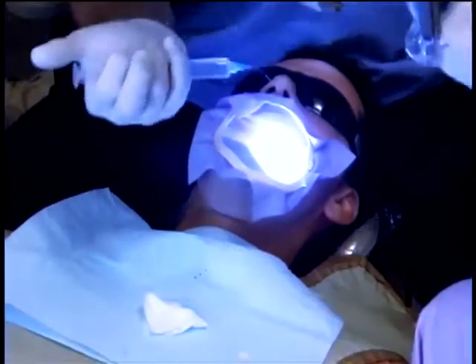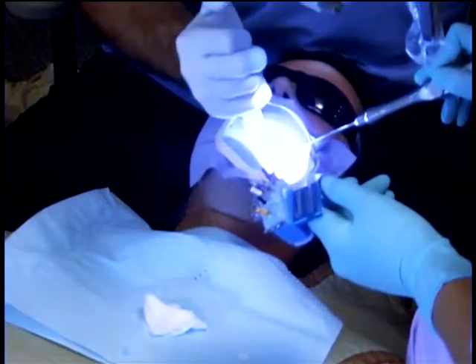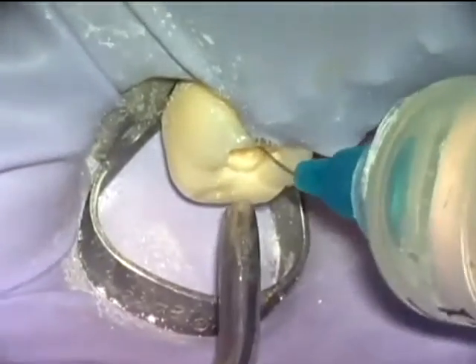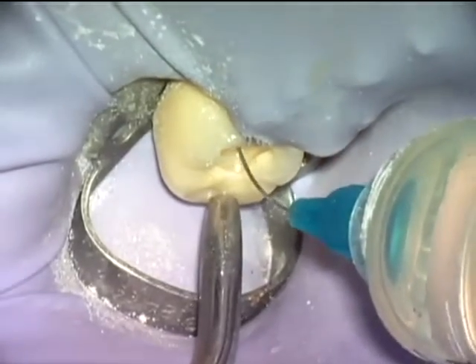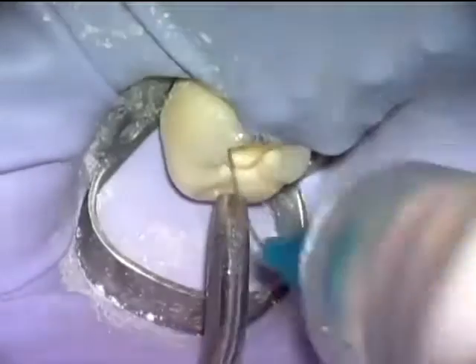Sodium hypochlorite is used as an irrigant during shaping. I use ProRinse 30 gauge needles because of their safe end and side vent. After all of the canals are negotiated to a size 15K file, the lubricant is replaced with sodium hypochlorite and we are ready to cut shapes in the canals.